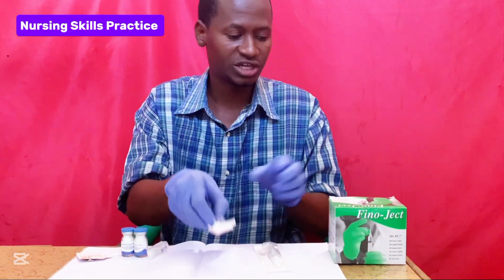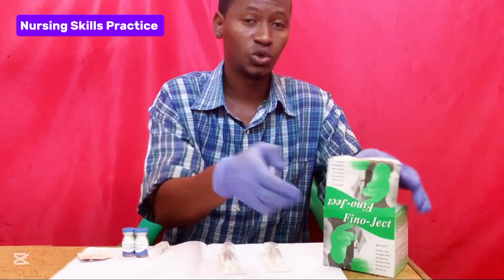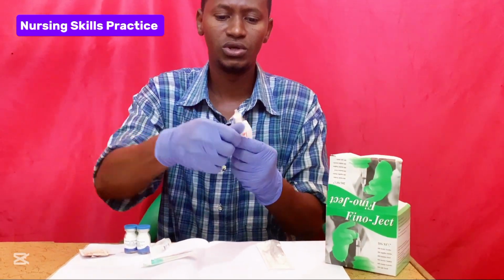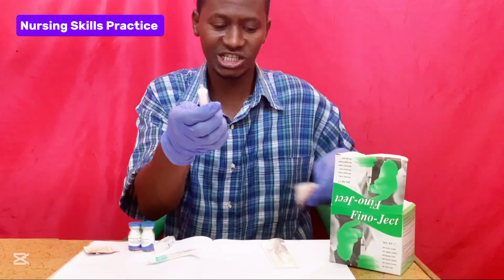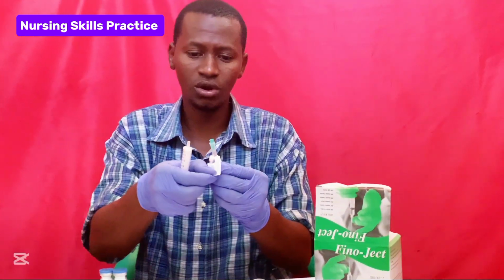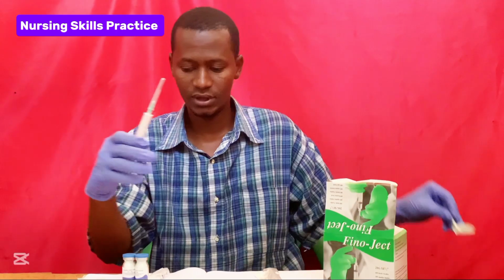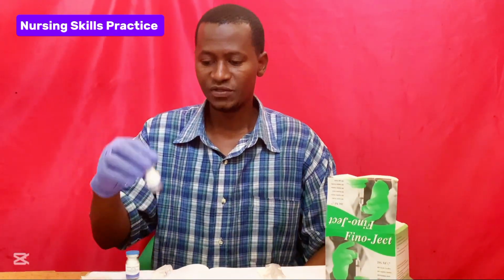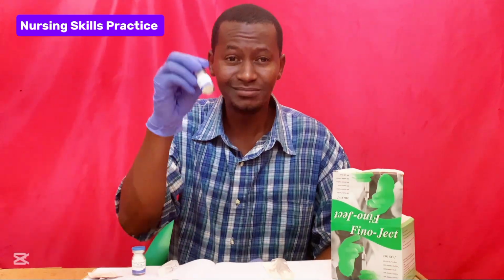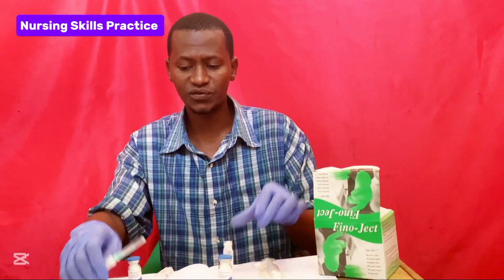You get the syringe together with a 21 gauge needle. You remove the syringe from the manufacturer's packaging, and you get the 21 gauge needle. Then you attach the needle to the syringe. This is the 500 milligram powder to be dissolved with 4.7 ml of sterile water for injection. So you get the sterile water for injection.